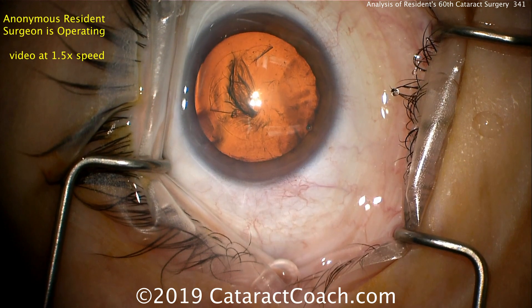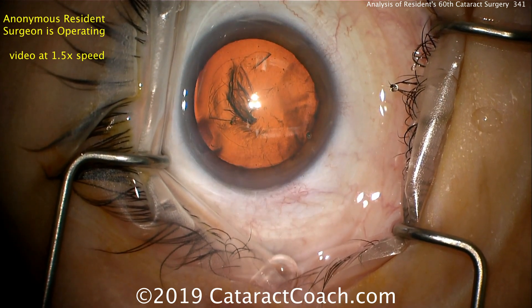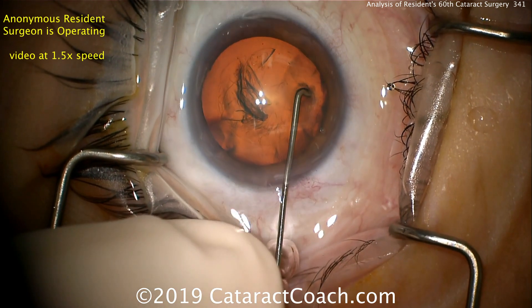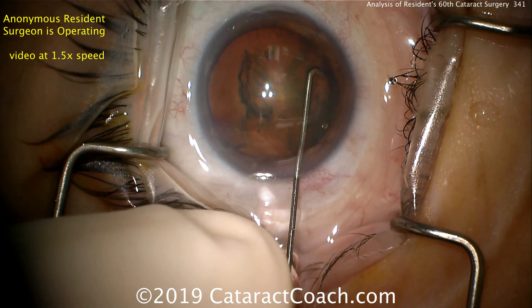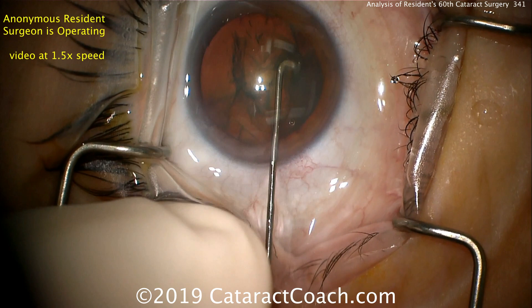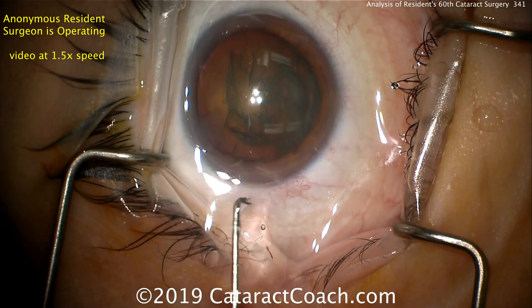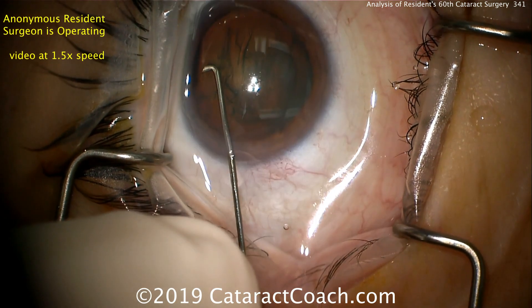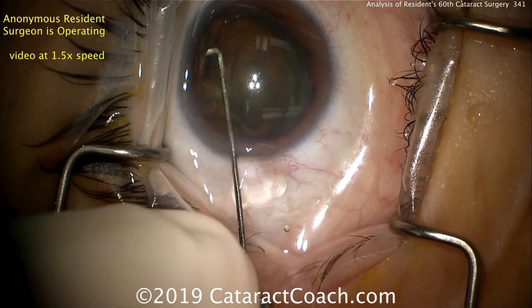You'll see the three Purkinje images — three lights on the surface of the cornea. That's the first Purkinje image, and the eye is staying in primary position. Here's a J-shaped cannula for hydrodissection. Good fluid wave there. Another fluid wave — notice how we also lose viscoelastic from the eye. We'll go the other direction as well, and this looks pretty good.